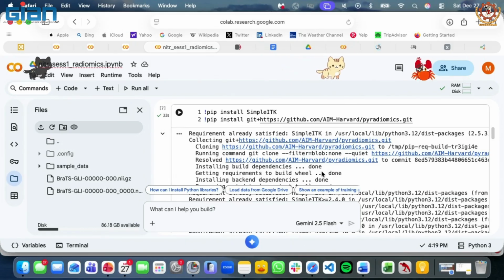For example, I can think of one of our research ideas which deals with not solid tumors but vessels of the lung. Lung vessels, of course, have shape, structure, intensity, everything. But to do meaningful prediction, vessels are very irregular in structure. So the first thing that comes to my mind: how long is this vessel? How many branches does it have? What's the tortuosity, that means the curvedness of these vessels? These are new types of radiomic features that you can think of if you have a different problem statement. From solid tumors to vessels, I thought of this set of features. If you have something else, you can think of some other set of features.